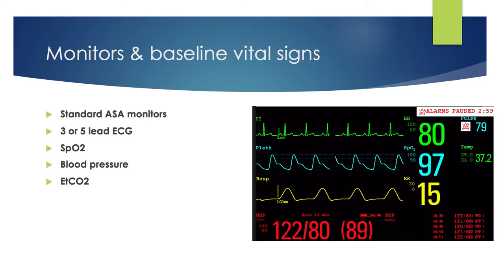After properly positioning the patient, apply monitors and obtain baseline vital signs. This includes 3 or 5 lead EKG, SpO2, blood pressure, and end-tidal CO2.